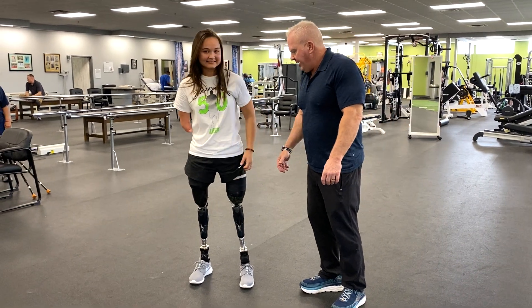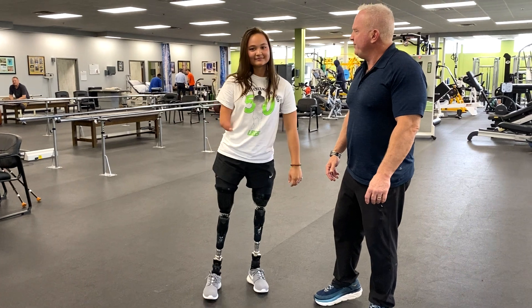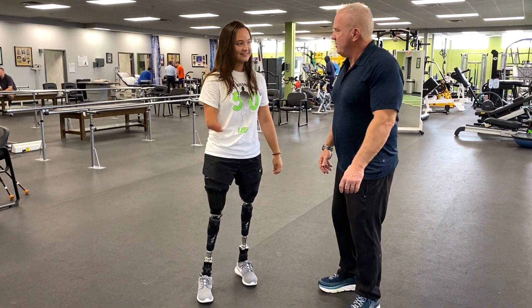So this is Ryan. She's wearing the bilateral PPS system. Ryan, you've been in it for how long now? Since June of last year. So quite some time now.